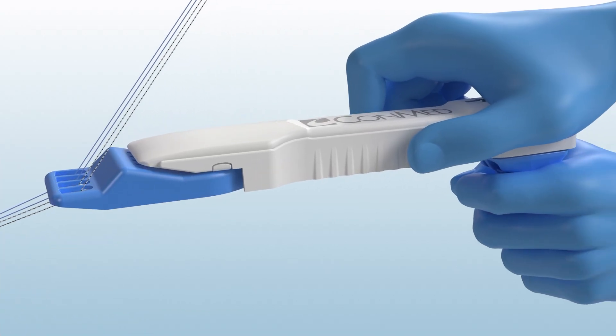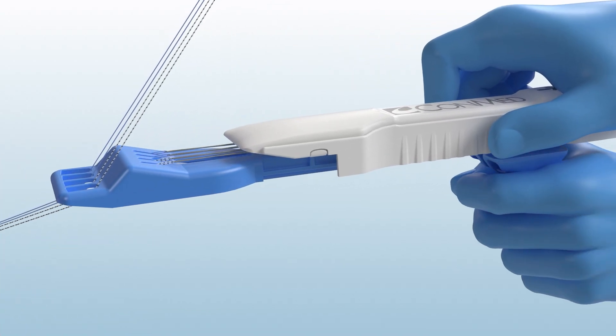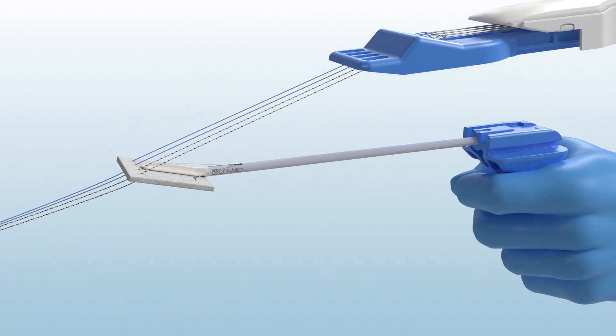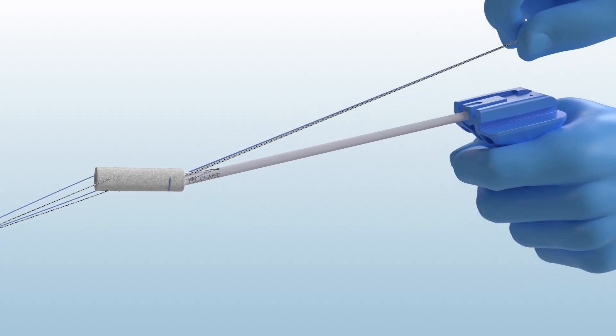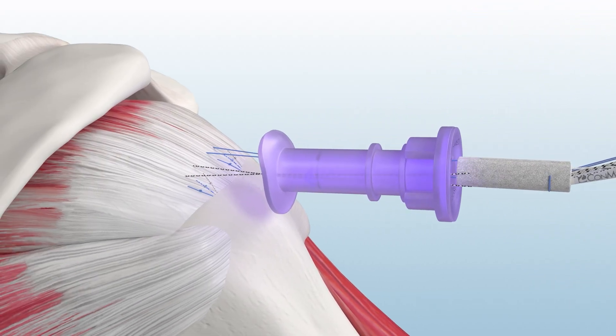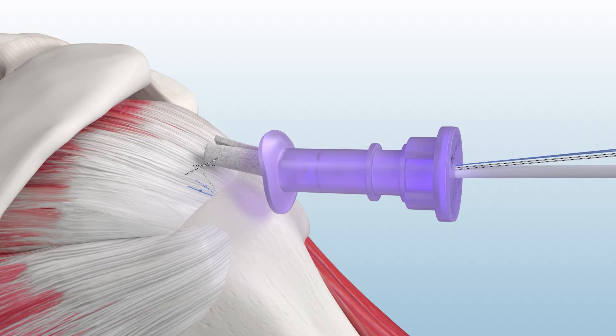To load the medial suture through the Biobrace implant, simply hold the blue handle and pull the suture loader in the direction of the arrow. Maintain tension on the medial suture while delivering Biobrace through the lateral cannula.